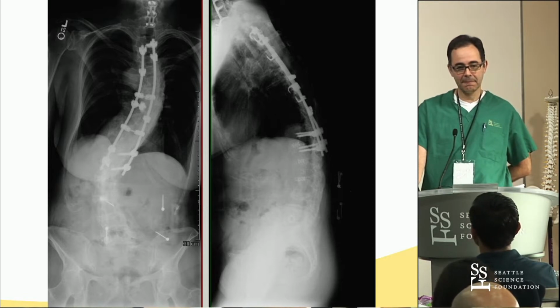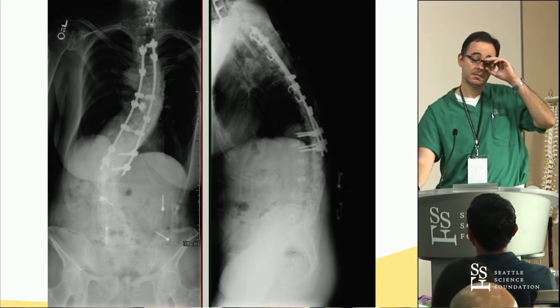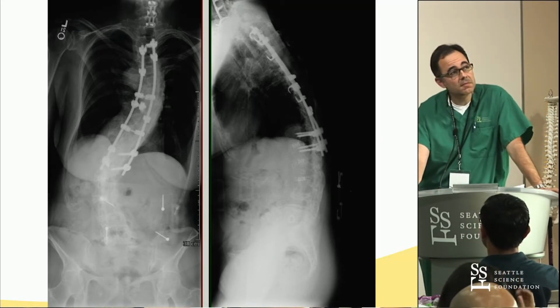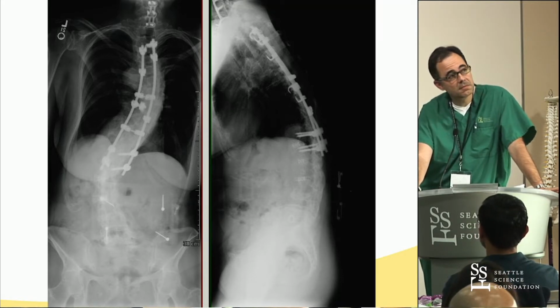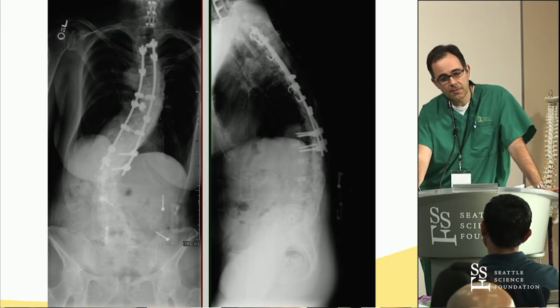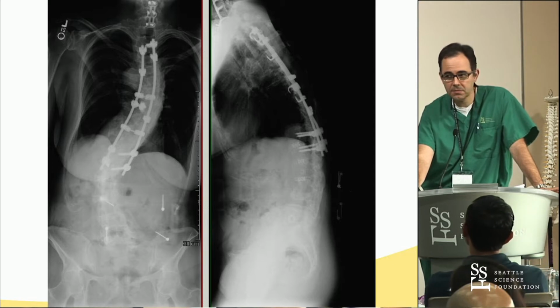I think that despite the fact that the lumbar spine is solidly fused, it obviously is lacking in the lordosis and maybe even has some kyphosis at the top. It's hard to tell, but it doesn't look like they did anything necessarily at 5-1, so maybe start with a 5-1 ALIF to see how much lordosis you can get out of that. Okay, she has a solid fusion at 5-1. If the posterior elements are all solidly fused. Yeah.